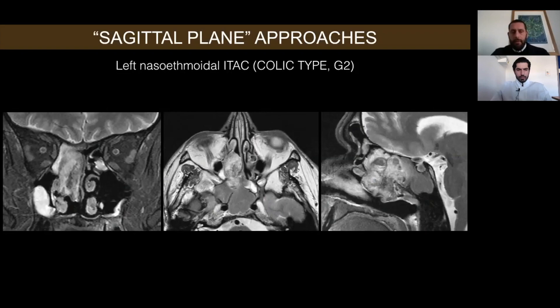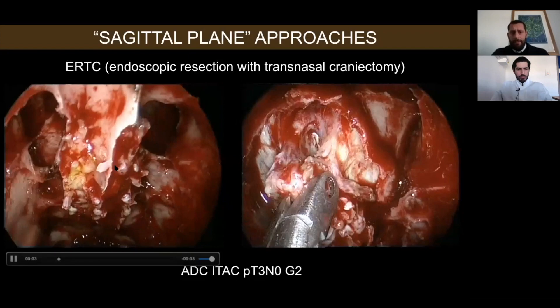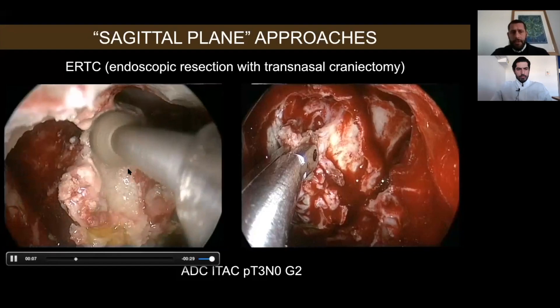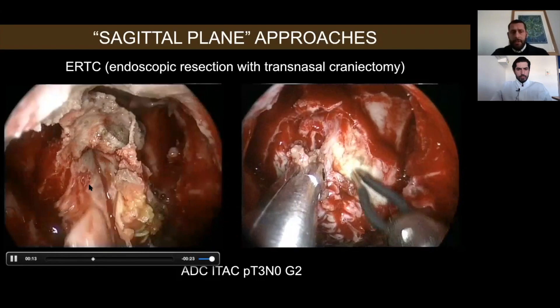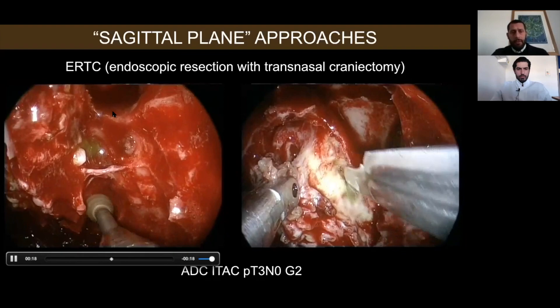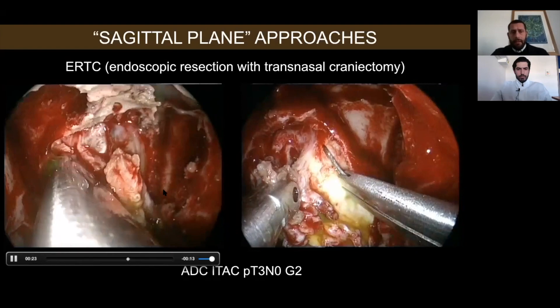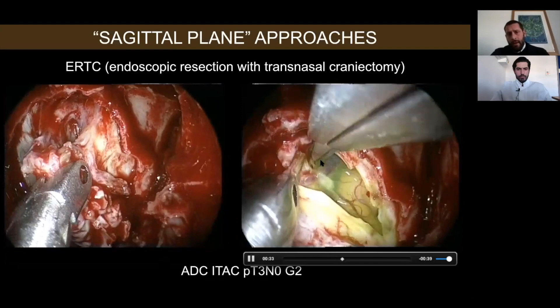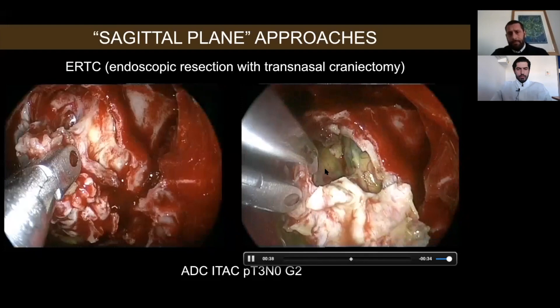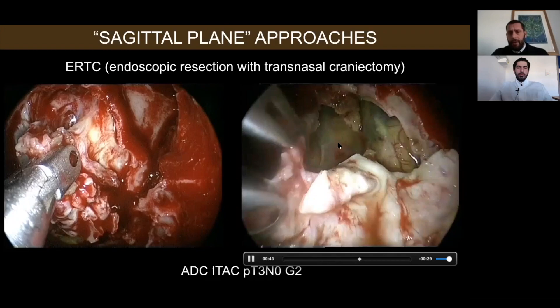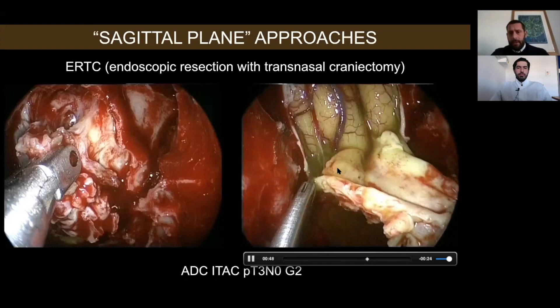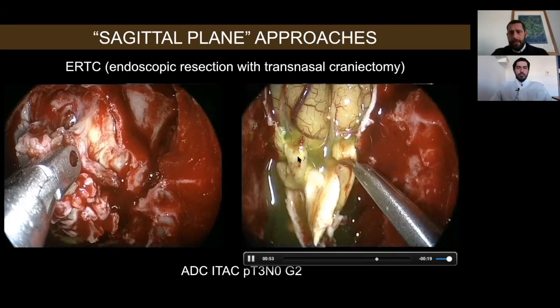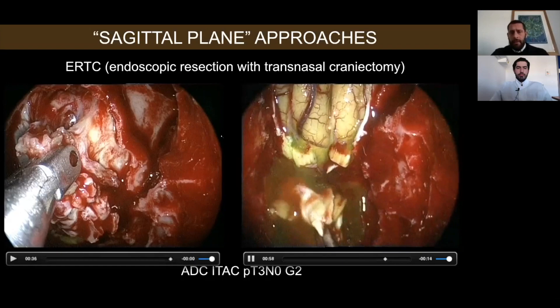This is an example of application of the transcribriform approach for intestinal-type adenocarcinoma of the right nasal fossa. The tumor was already removed from the nose, but to reach free margins we also had to remove the skull base. We are preparing the skull base, cutting the ethmoid arteries bilaterally, removing the bone, and detaching the dura from the surrounding bone. Very carefully, we open the dura — remember the arachnoid is very adherent to branches of the medial orbital frontal artery, so you must carefully dissect it to avoid dangerous bleeding. We then cut the olfactory tracts bilaterally so the olfactory bulbs are both included in the specimen.